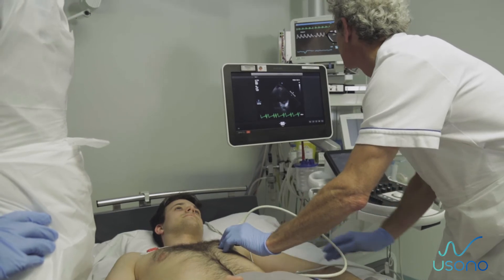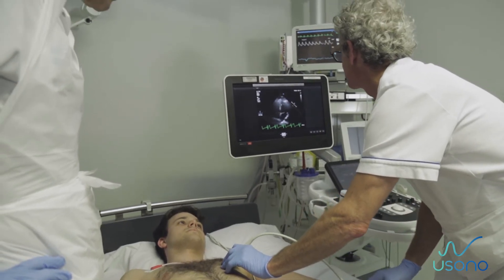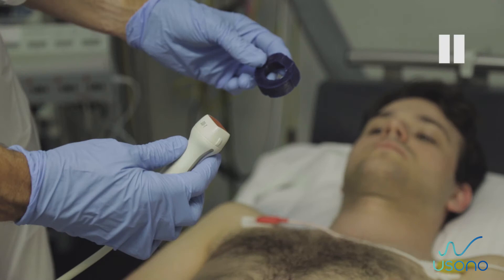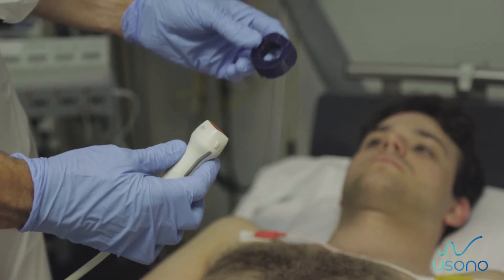Optional: If needed, scan the body before installing the probe fix to determine correct placement. Step 3: Select the correct silicon ring insert based on the probe being used, and open the silicon ring insert.